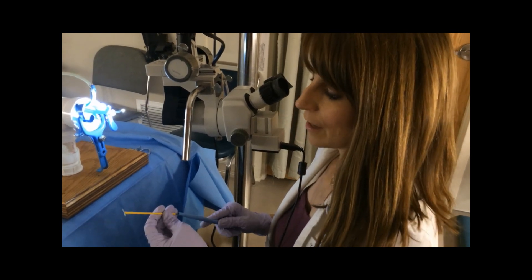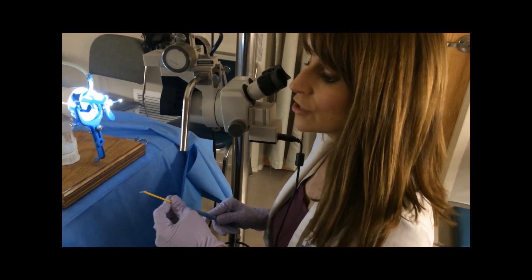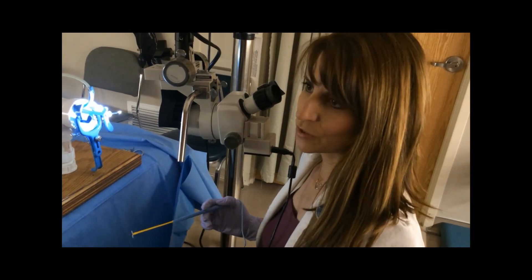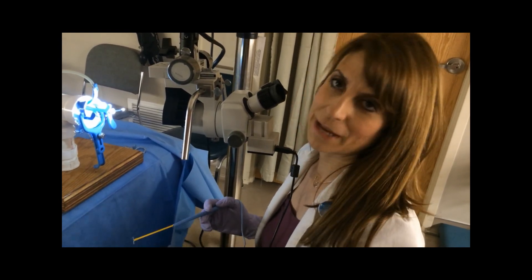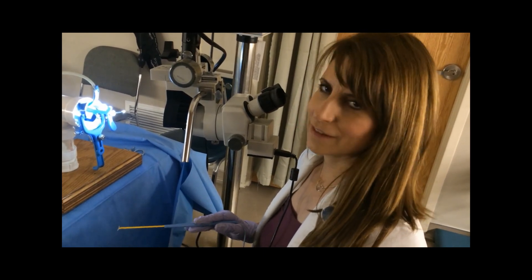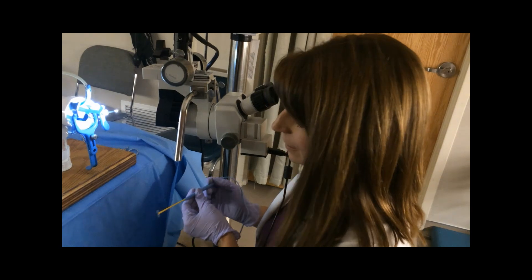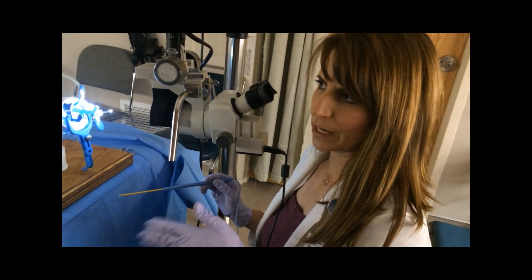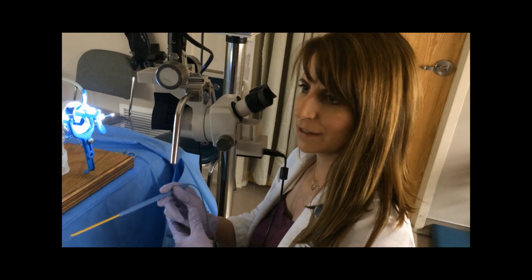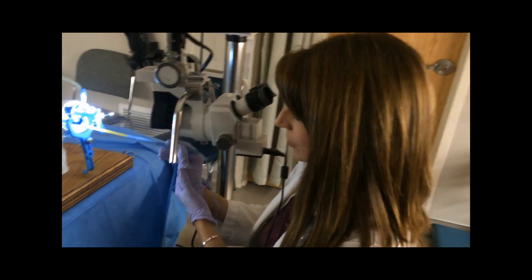There are many providers that will do these in the operating room, and I do provide them in the operating room, but I also find this works well in the clinic setting if you pick the right patient. If you have a patient who's way too nervous, then it is better to do it in the operating room. Or if you have a patient you're worried about having excessive bleeding — I've done some on HIV-positive women in the operating room.